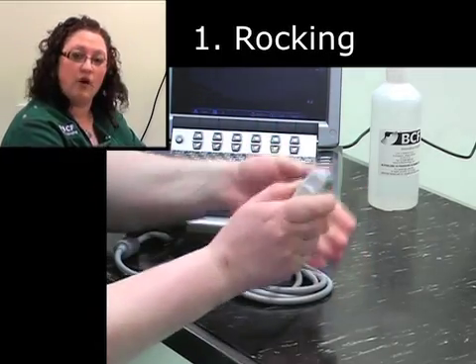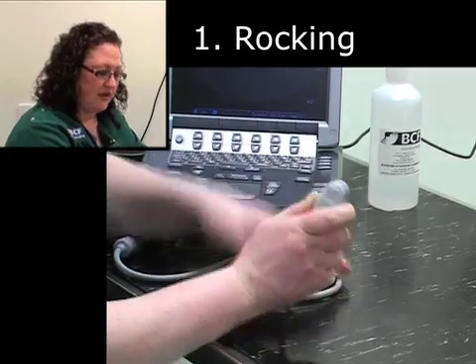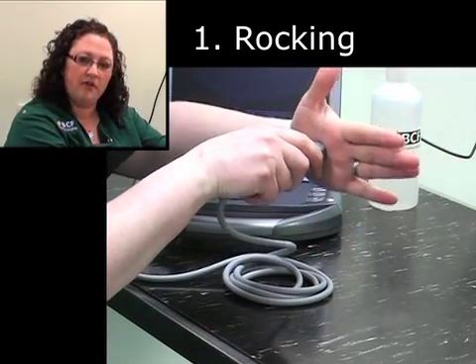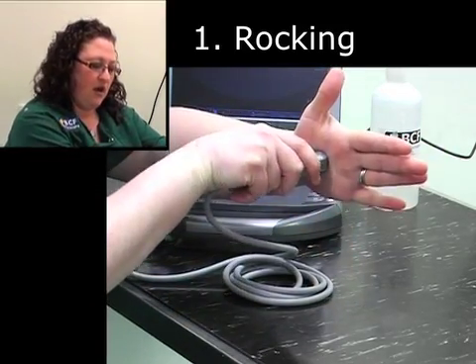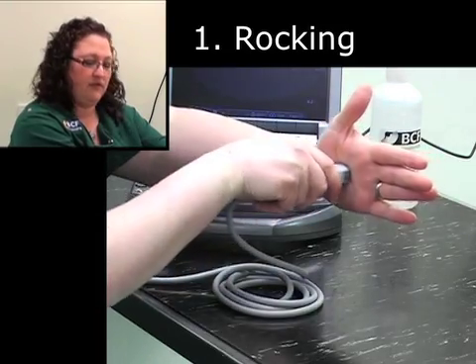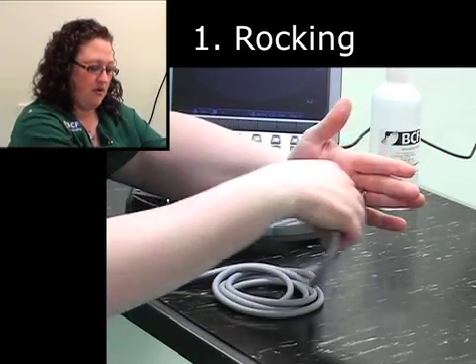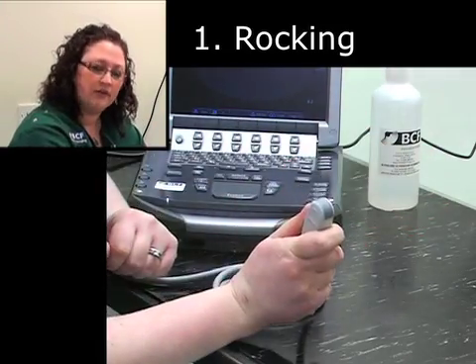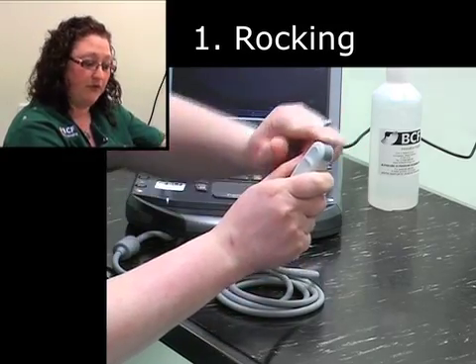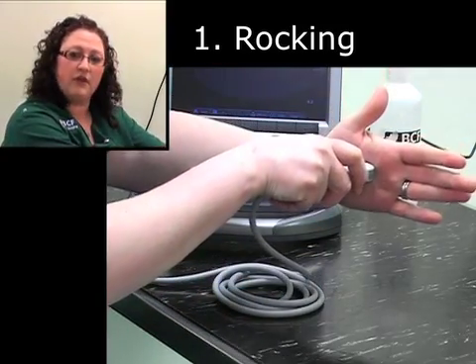Rocking is placing the probe on the patient and moving it side to side. This is along the surface of the crystals or the footprint itself.